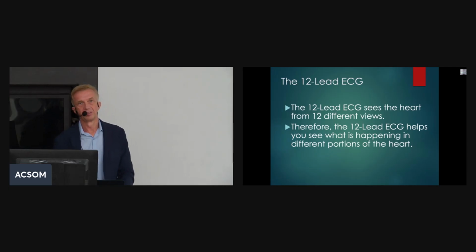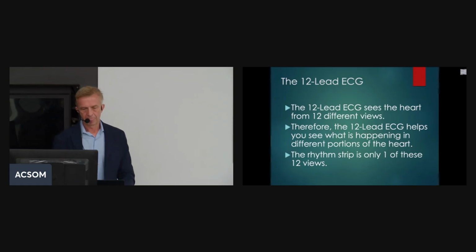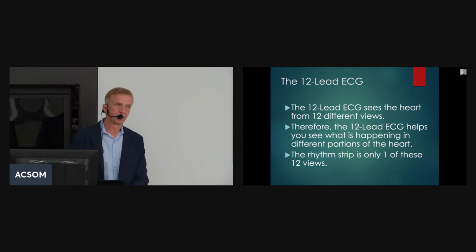There are two types: ST segment elevation or non-ST segment elevation. Patients who have elevation of the ST segment of more than 1 millimeter in 2 consecutive leads raise high suspicion for acute ST segment elevation myocardial infarction. Patients who have non-ST segment myocardial infarction have ST segment depressions. Again, 1 millimeter ST segment depression in 2 consecutive leads in patients with a typical presentation suggests they may have acute non-ST elevation myocardial infarction.